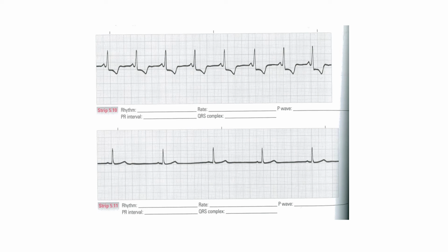Now let's do our QRS. Now the challenge with this one is that you have some ST depression, so you actually have to pull it up. So for your QRS, I'm measuring from the beginning, and I'm kind of right here, and you're counting how many boxes between there. And it looks like some of them are only 1 box, some look like maybe 2 boxes.